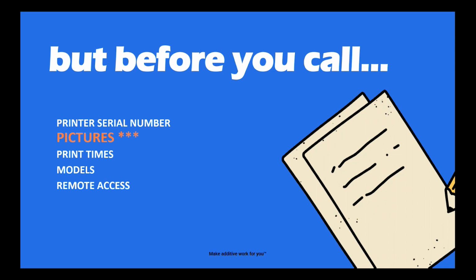And if you're outside of the US, please call your service bureau or reseller or whoever you get your service through. Now, before you call, this is the big list for us. It's pretty simple, but it's extremely important and helps just get things accomplished as quickly as possible. Obviously, your serial number. You wouldn't believe the amount of emails that we get, and people just say, hey, this is going wrong, and don't tell us who they are or what printer they're talking about. So serial number is super important.